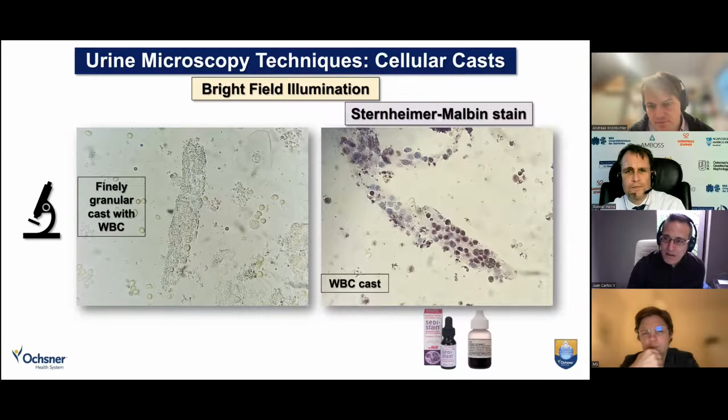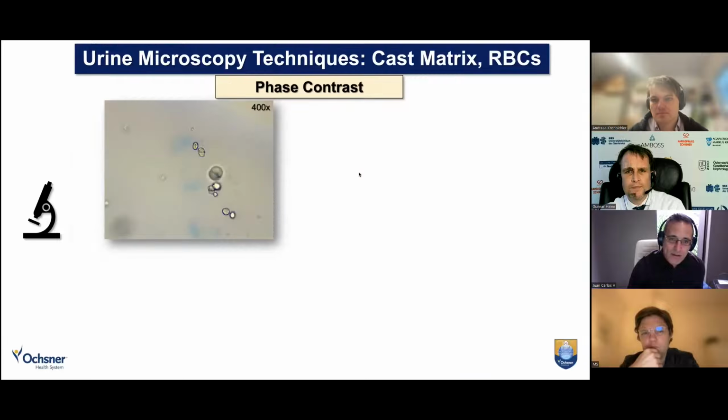That's something that I actually learned late in my career. I didn't know about this as a trainee until I got the stain from a friend and realized that it was much more helpful to recognize structures within casts, particularly cells, particularly white cells.